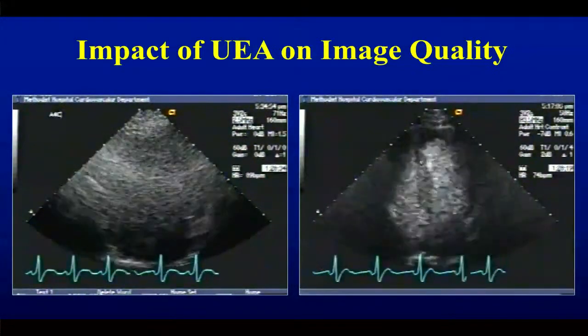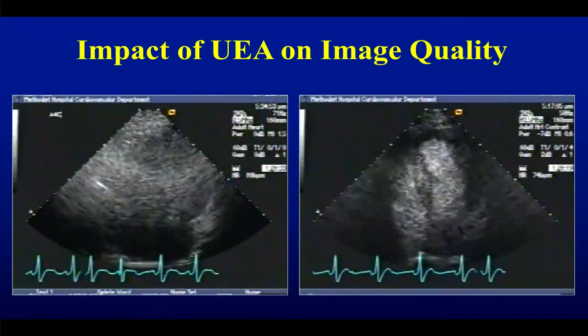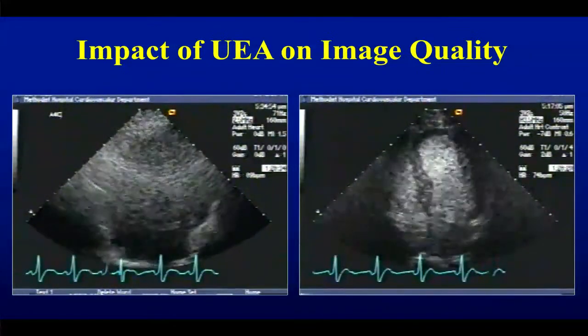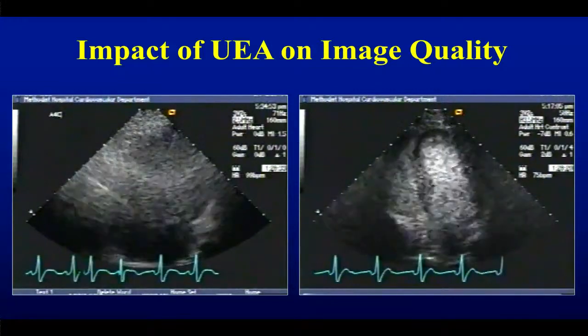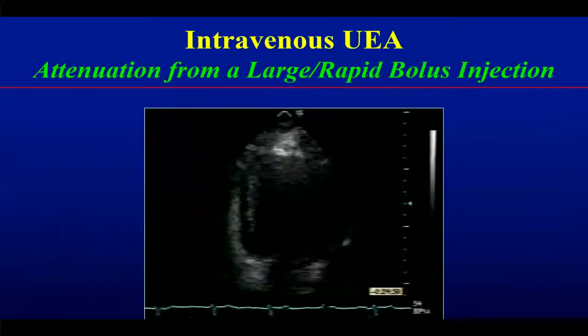And the current indications, as we will see, is if I can't see maybe 2 segments or more, it will enhance my diagnostic accuracy and hopefully also alter my management down the line.